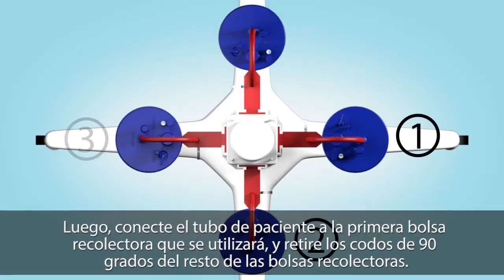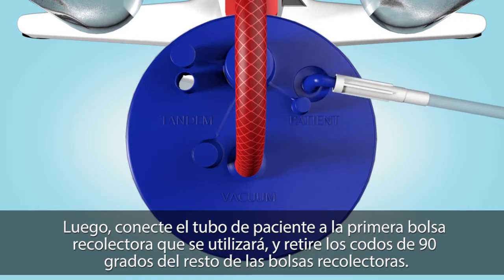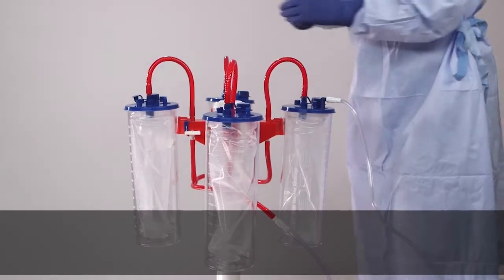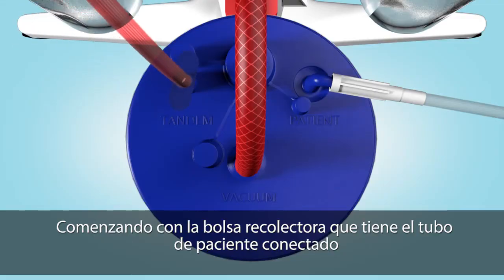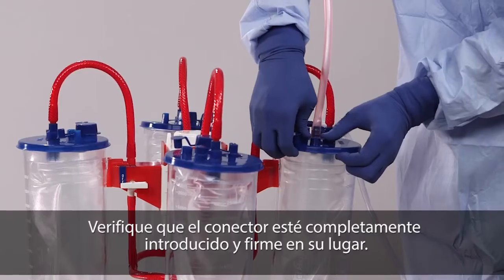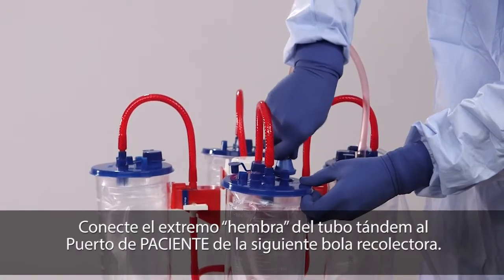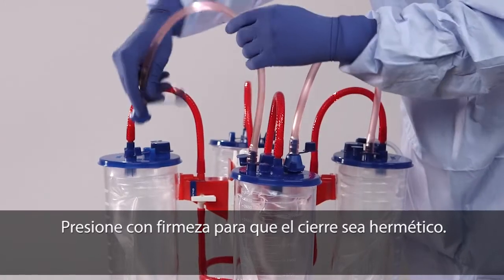Connect the red braided tube to the vacuum port using a push and twist motion. Repeat with each liner. Next, attach the patient tubing to the first flexible liner to be used and remove the 90-degree elbows from all remaining liners. Starting with the liner that has the patient tubing attached, insert the male end of the tandem tube into the tandem port. Verify that the connector is inserted fully and locked into place — listen for a click. Attach the female end of the tandem tube to the patient port on the next liner. Press down firmly to seal the connection.